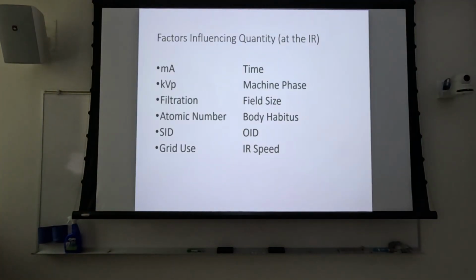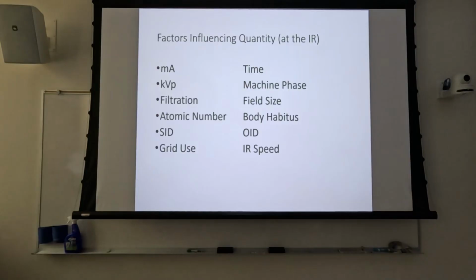Again, you can go back to that three-part series on kVp or previous lectures and see that. But we emit more of the scatter that we create inside of the patient, right? So remember, as kVp goes up, all interactions actually go down, but the percentage of scatter compared to photoelectric increases.